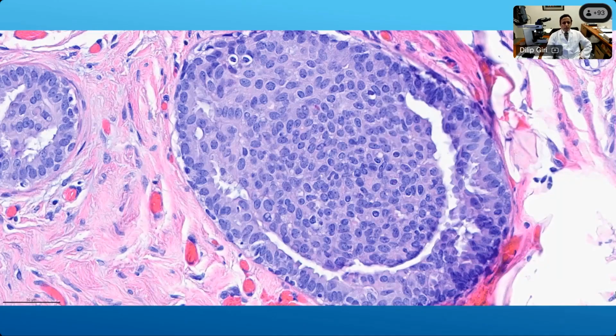Sir, this is usual ductal hyperplasia. Why do you say this is usual ductal hyperplasia? Sir, there is nearly a similar type of cell, nearly a similar type of hyperpigmented cell with lumina also. Okay. Yes. So how would that be different from DCIS?